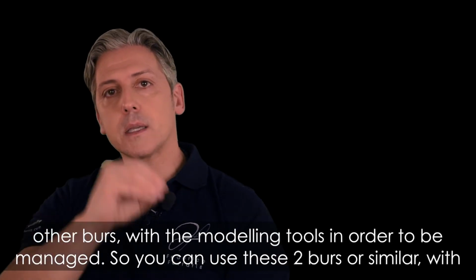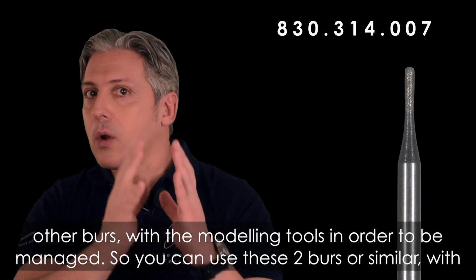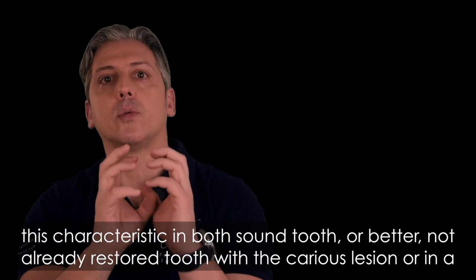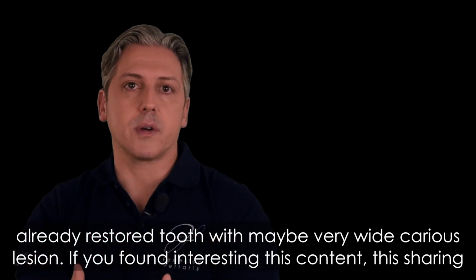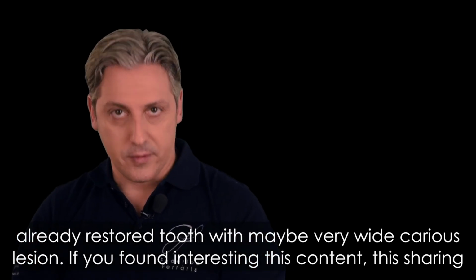Okay. So you can use these two burrs or similar ones with these characteristics in sound tooth, or better, non-restored tooth with the carious lesion, or in already restored tooth with maybe a very wide carious lesion.